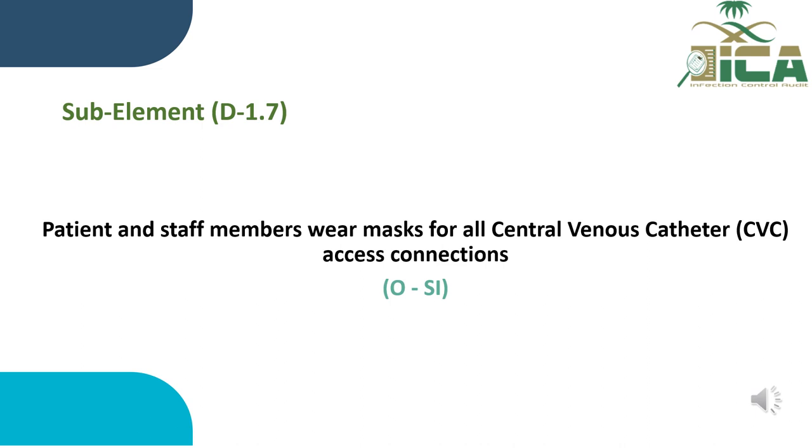Sub-element D1.7. Patients and staff members wear masks for all central venous catheter access connections. We evaluate this sub-element by observation and staff interview.